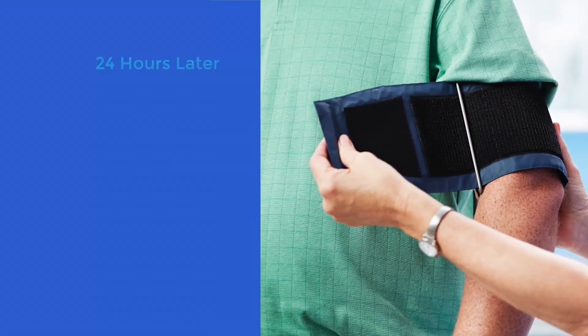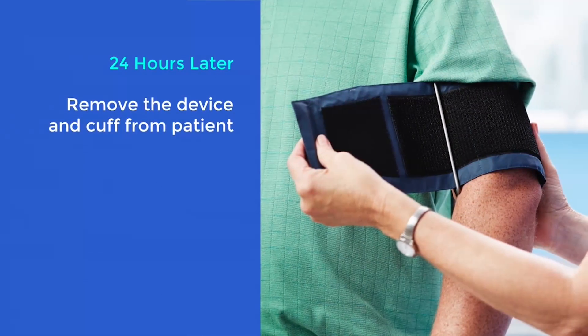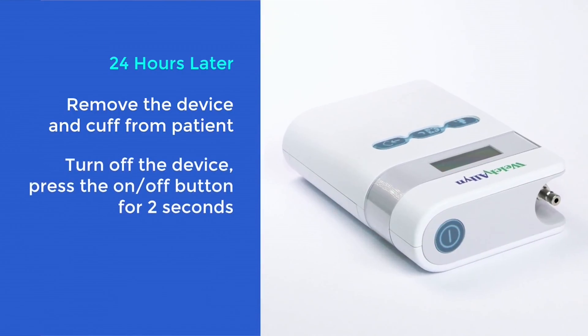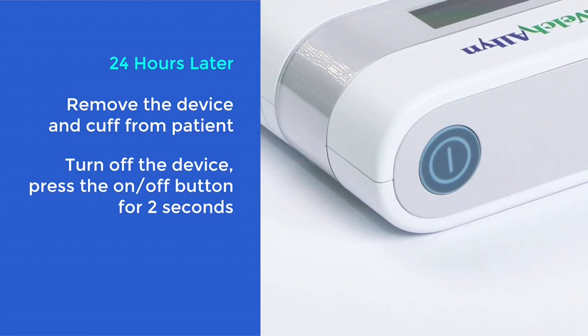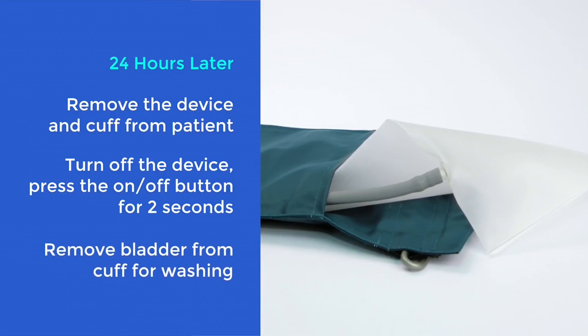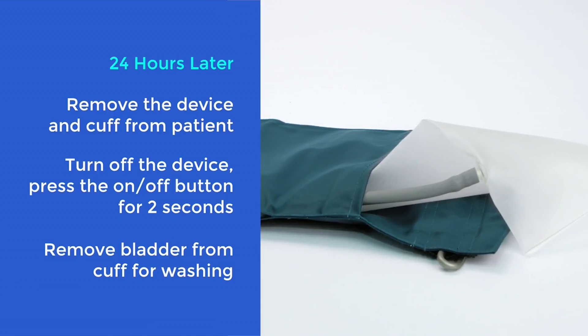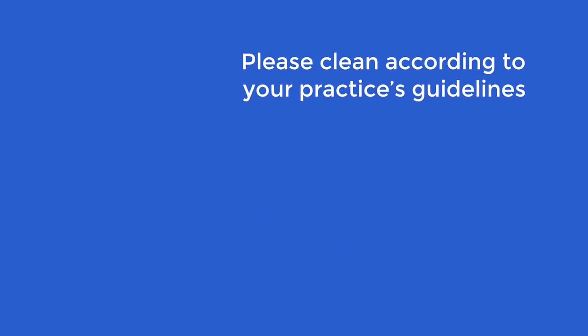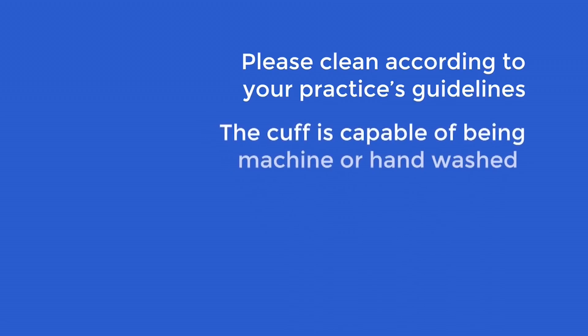After 24 hours, the patient should return to have the ABPM removed. Once removed, turn the device off by pressing the on-off button for 2 seconds. You must take the bladder out of the cuff and thoroughly clean the outer cover before using it on a new patient. Please clean according to your practice's guidelines. The cuff is capable of being machine-washed or hand-washed.